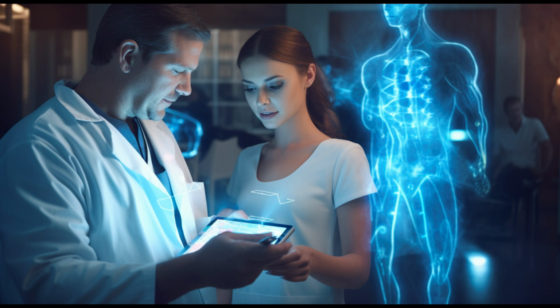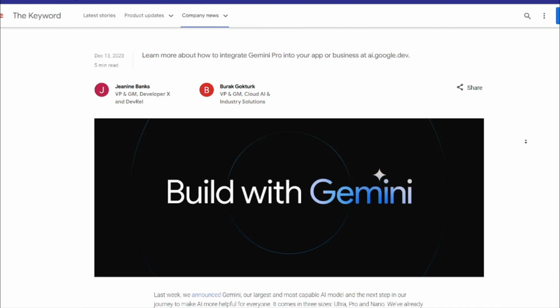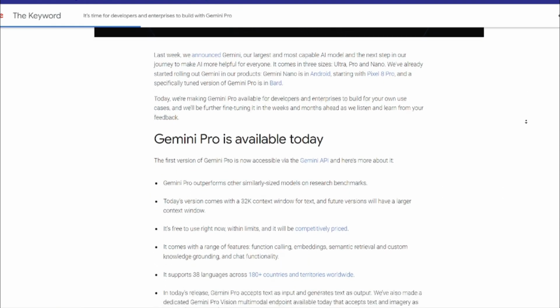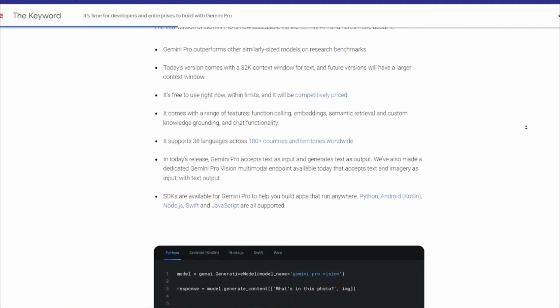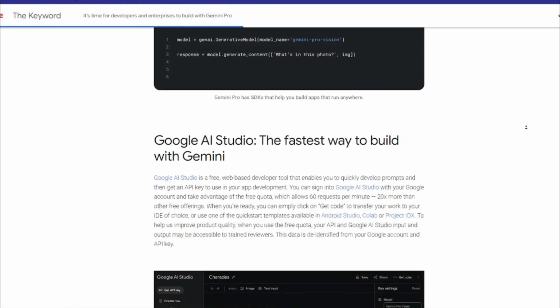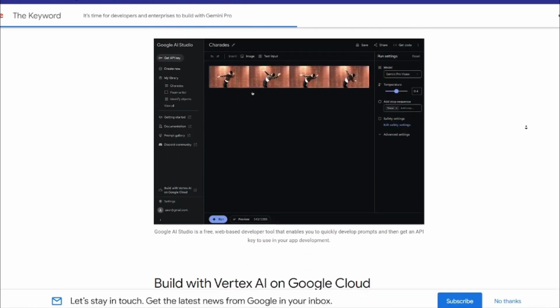Upload any medical image and watch as Gemini Pro Vision, a cutting-edge AI model, unveils the hidden story. Get instant recommendations, uncover potential problems, and explore treatment options, all at your fingertips. No more cryptic doctor speak, no more endless Googling. This application puts the power of medical AI in your hands.